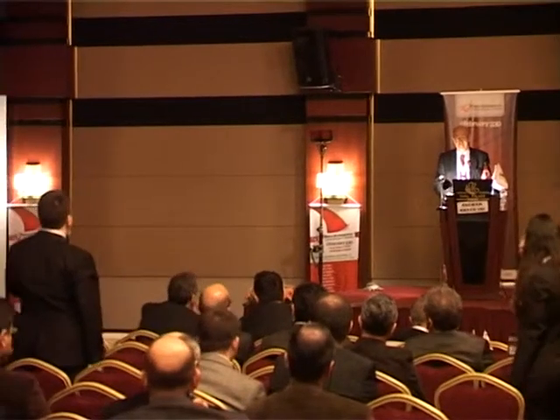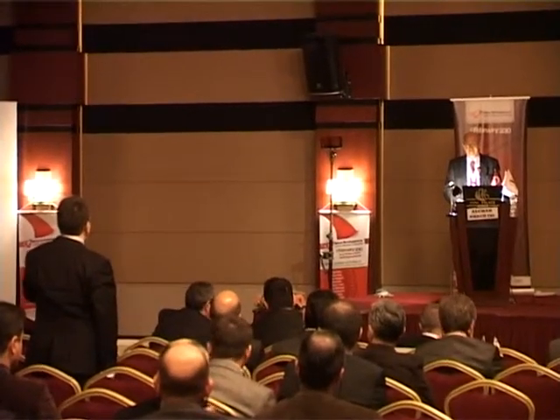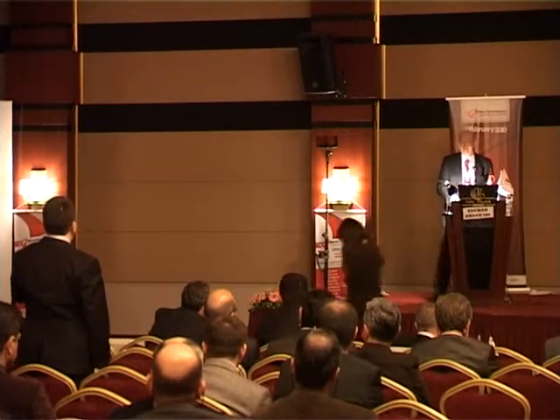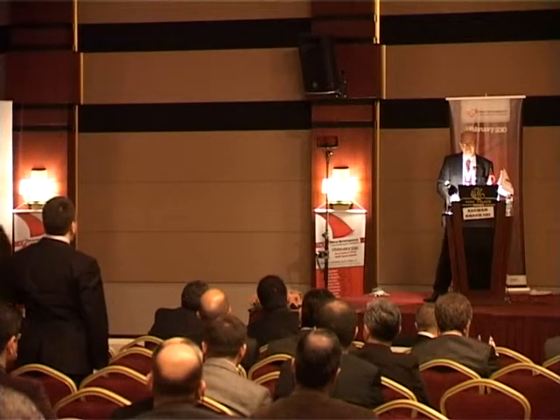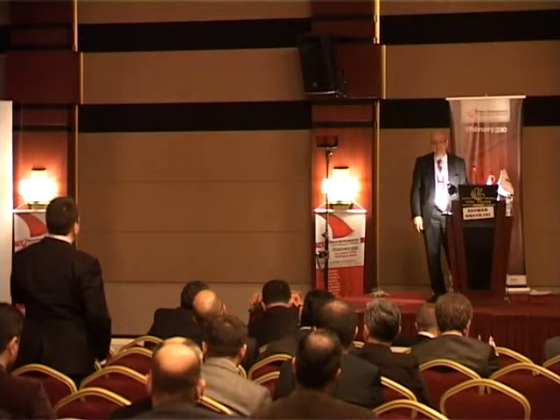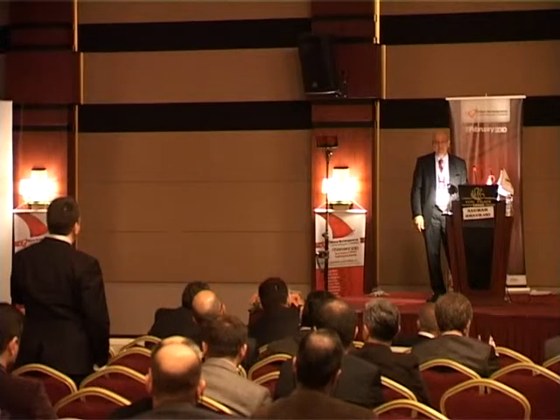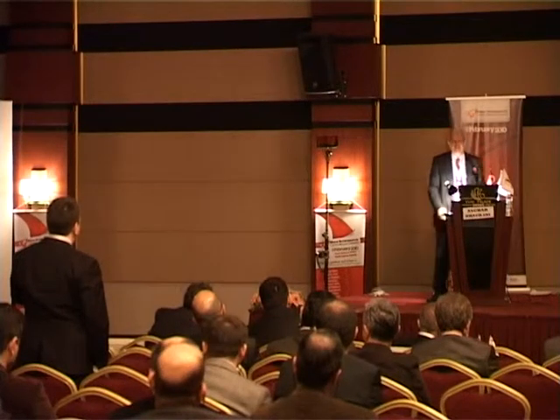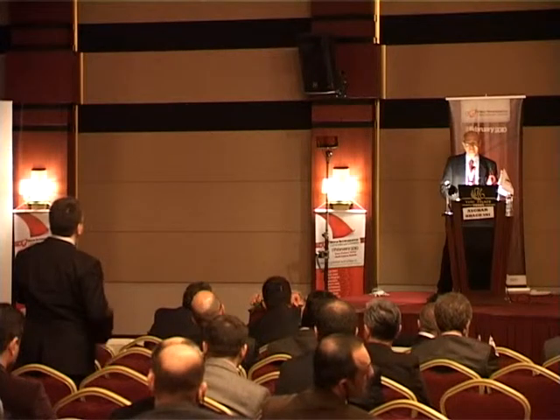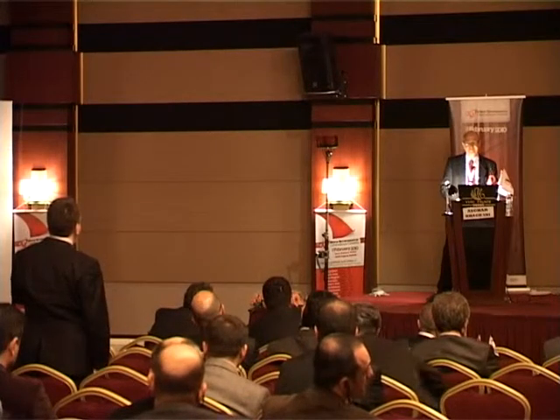Professor Khaghani, thank you very much for sharing your experience with us. I want to ask a question. You are implanting this device with fibrillation. I mean, you didn't do any cardioplegia. This is one thing I want to ask, and I want to ask another question. Do you combine stem cell experience with this device?